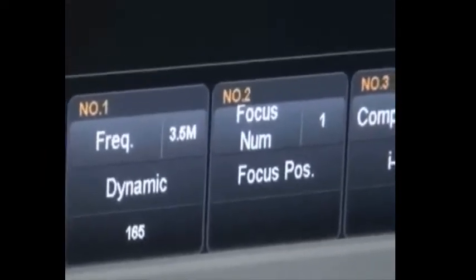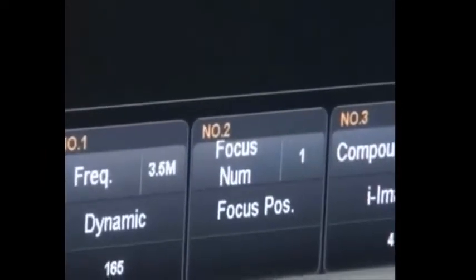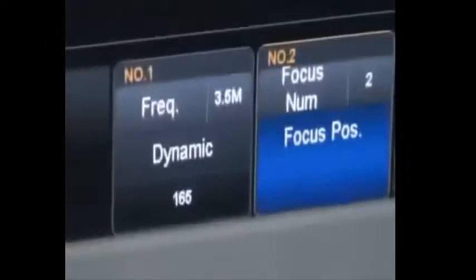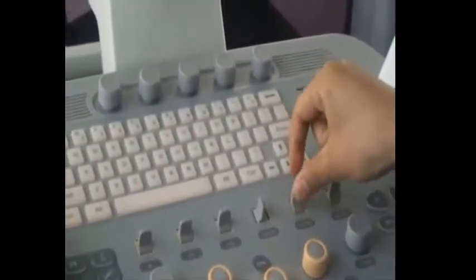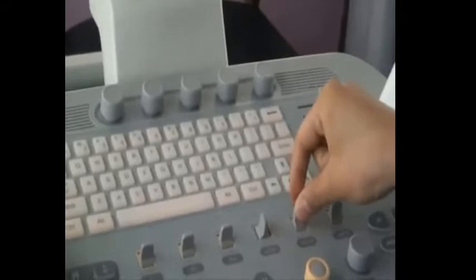Focus number and focus position. We can press to change the focus number and rotate to change the position. Also up and down to change the focus position.